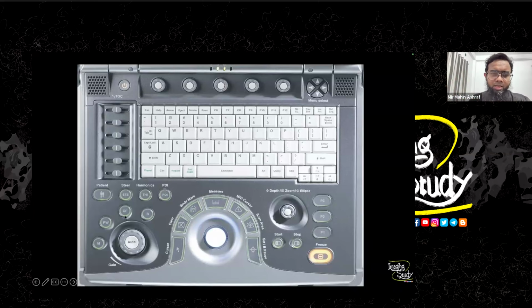There are some modes like B mode, color flow. This is a Doppler enabled machine, with pulse wave Doppler. It doesn't have any continuous wave Doppler. There is M mode, and there are power Doppler imaging options. There are some save options. These are included in these power buttons depending on your need. And also we have a keyboard.